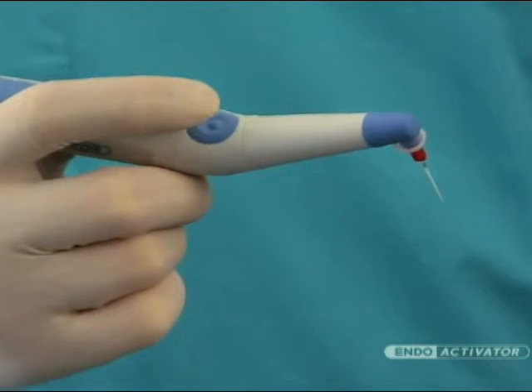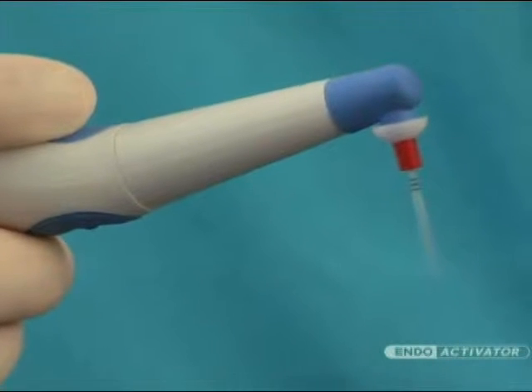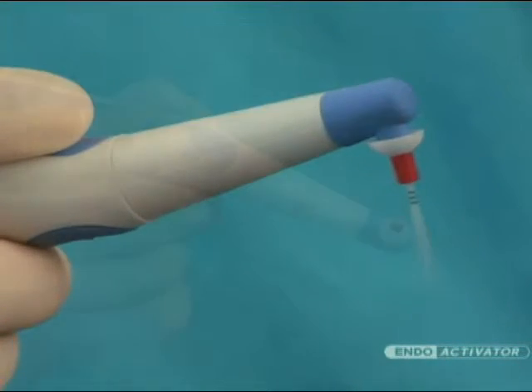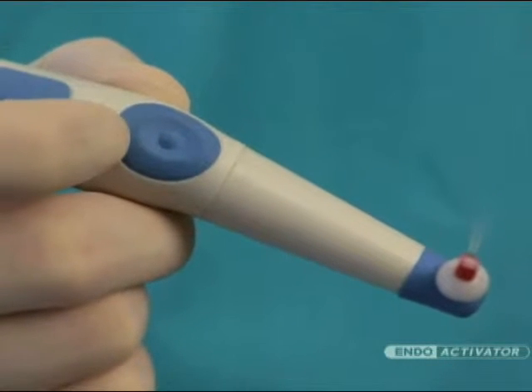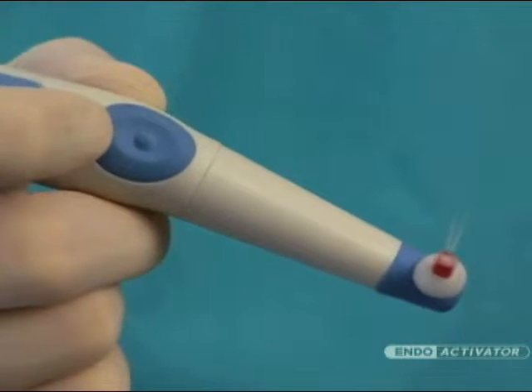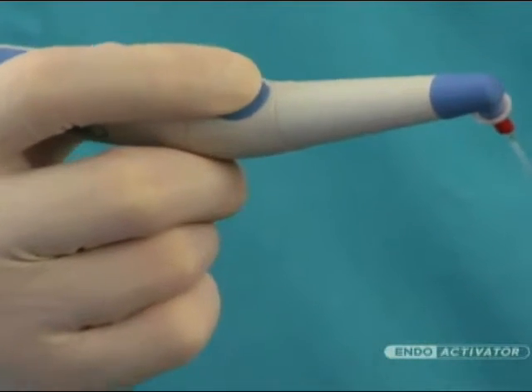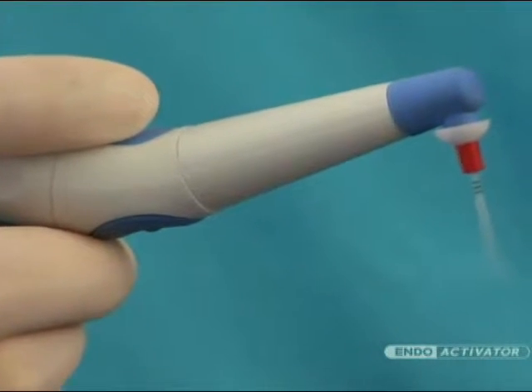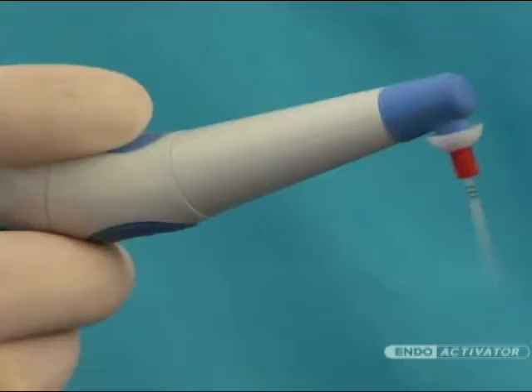This handpiece is operated by pressing the light-touch on-off switch, which activates the strong and flexible polymer tips. The three-speed sonic motor switch provides options of 10,000, 6,000, and 2,000 cycles per minute. When the driver is activated, the power defaults to 10,000 cycles per minute, which is the recommended speed to maximize debridement and disruption of the smear layer and biofilm.